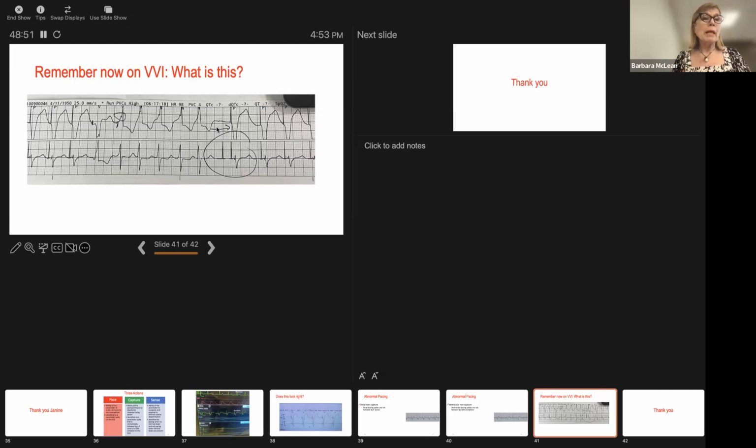So I'm calling EP and I'm going to say in the V lead that I've made sure my V leads are in the right position. I'm having a delay between the spike and the capture. That's why I think down in the ECG, they were saying failure to capture.